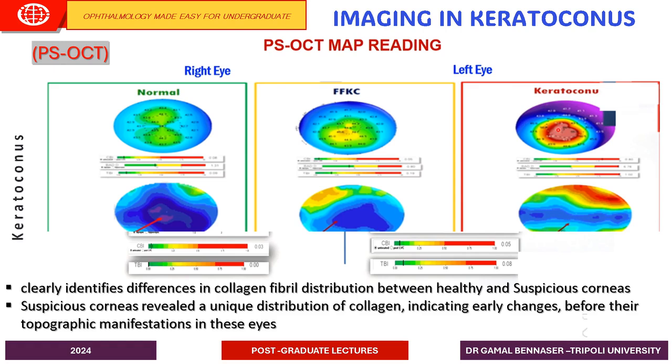So by utilizing this technology, as I said, it is very useful in early detection and for refractive screening for keratoconus or iatrogenic ectasia.